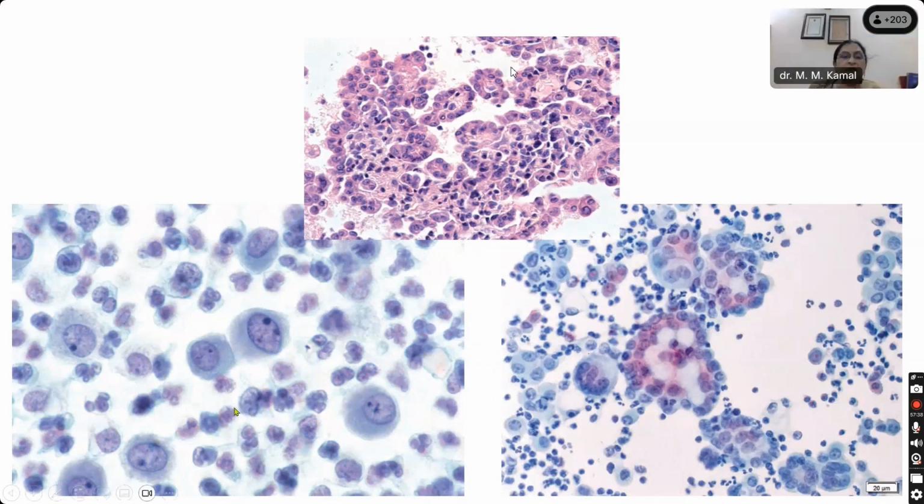Now here are some more examples of mesothelial cells. Single cells we have talked about. You can see the nucleoli, and they can be single or multiple, of varying sizes. That is what you are seeing. Then you can have this arrangement. What is this looking like?